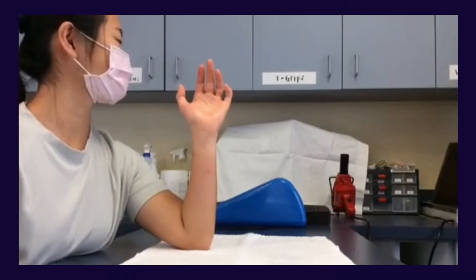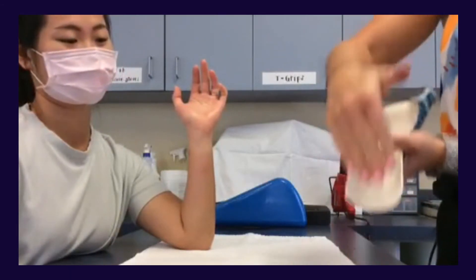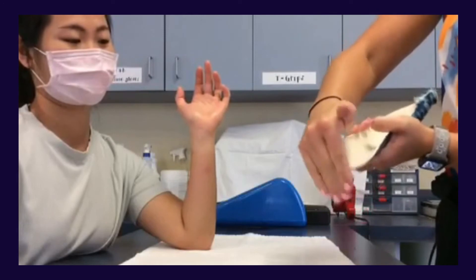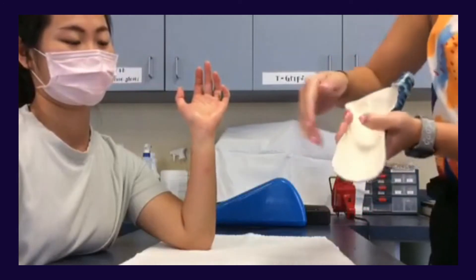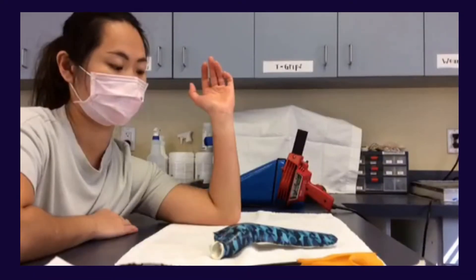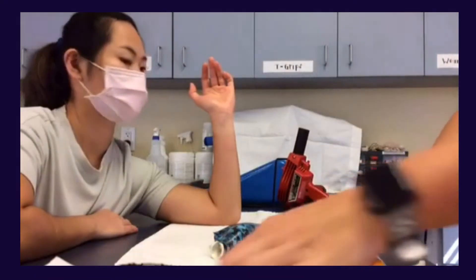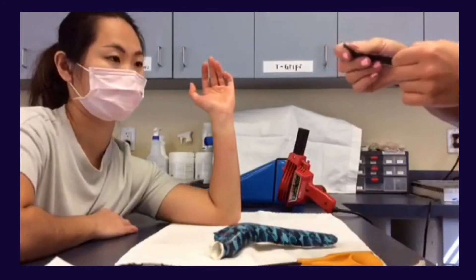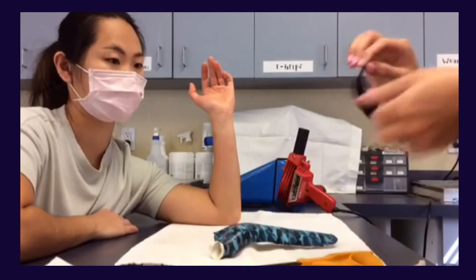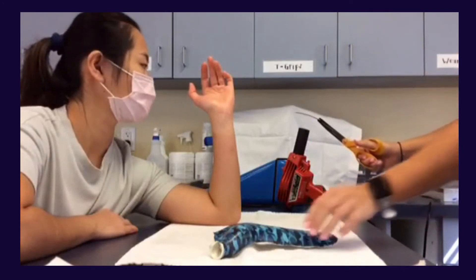Finally, flare out the proximal portion of the orthosis so the material is not digging into the patient's forearm. Next, apply your hook velcro onto the orthosis. You should have at least three straps, one around the thumb if needed for support. Apply the velcro using heat — it will help the velcro stick onto the thermoplastic easier.